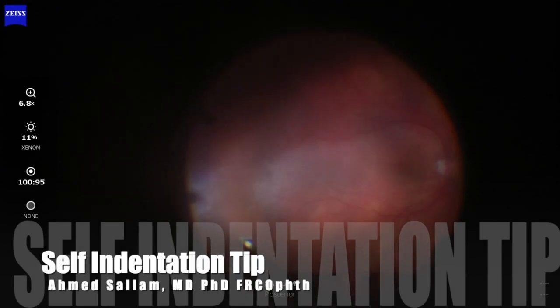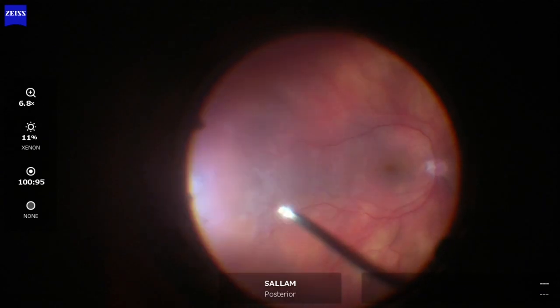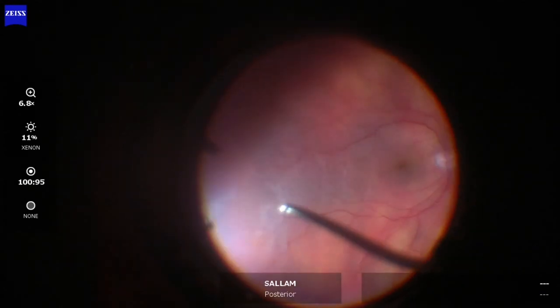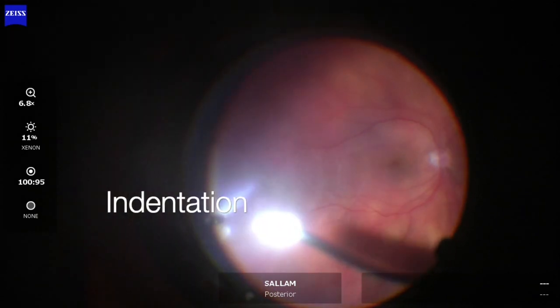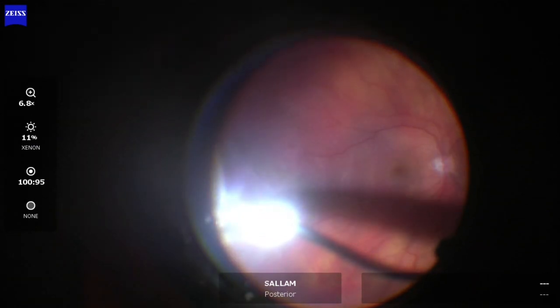This is a phakic patient with supratemporal retinal break and a temporal macular retinal detachment. This is the vitrectomy stage. Now cutting over the break to see it better and to remove the flap — I'm indenting on the break.